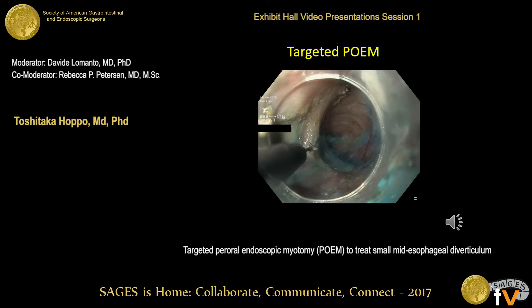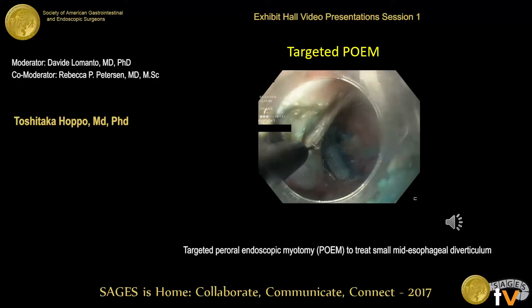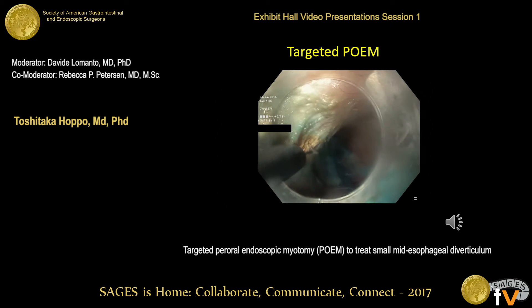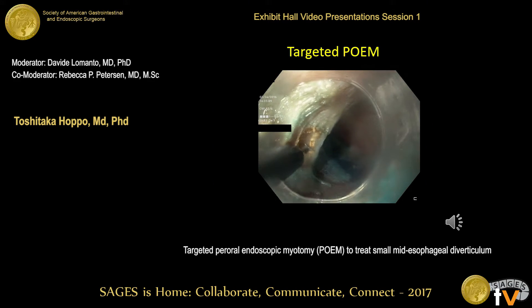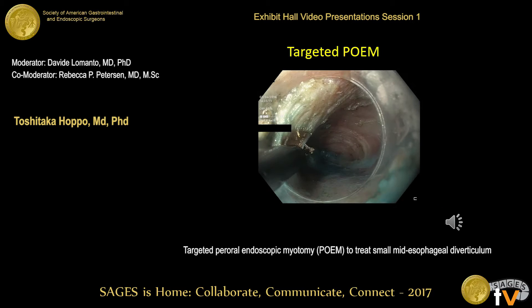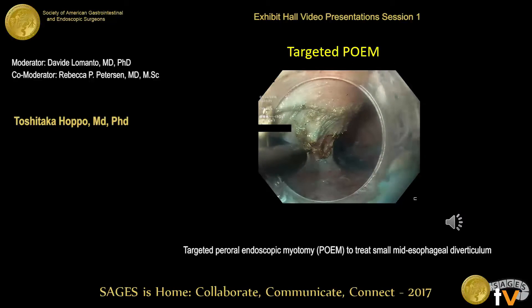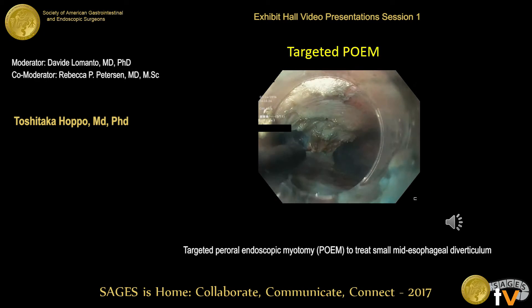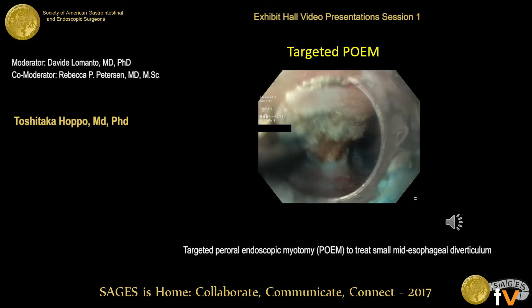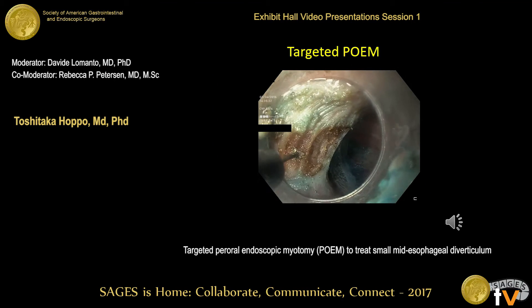The myotomy was initiated using the triangle tip knife. Based on the preoperative esophagram and chest X-ray, we knew the bronchus would be right behind this muscle band. So careful myotomy was performed under direct endoscopic visualization. I did not plunge the TT knife into the muscle fiber — I tried to divide each muscle fiber under endoscopic visualization. The plastic cap on the tip of the endoscope provided gentle pressure on both edges of the myotomy, giving good visualization.